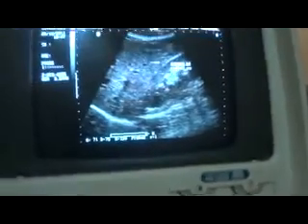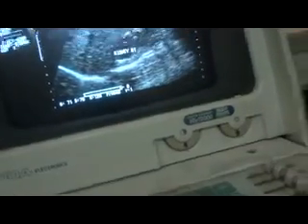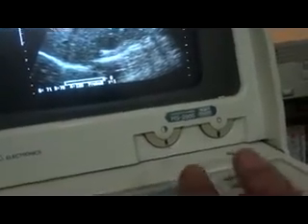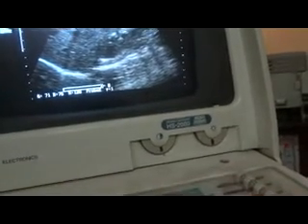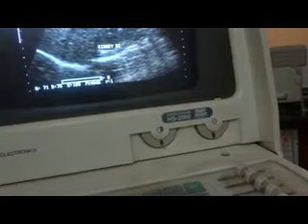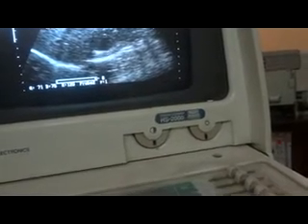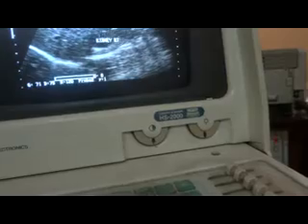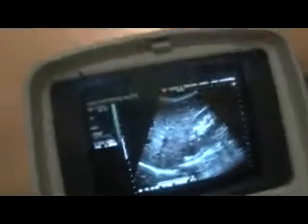We were studying the comparison of echogenicity of the liver with that of the right kidney. This is the right kidney, and this is the liver.